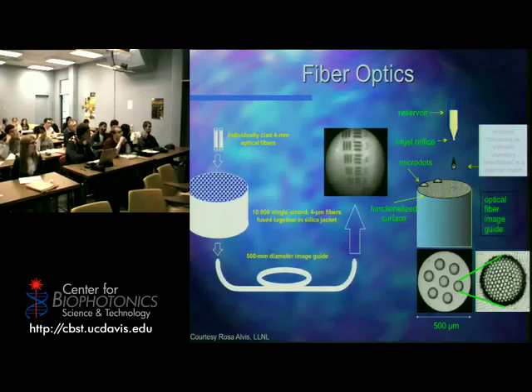She could look at something. She could put a little microscope at one end of this thing and put the other end on something really small, and she could see through it. The light would travel. So it's like an imaging guide. You have 10,000 pixels of an image. It's like a 10,000 pixel image.